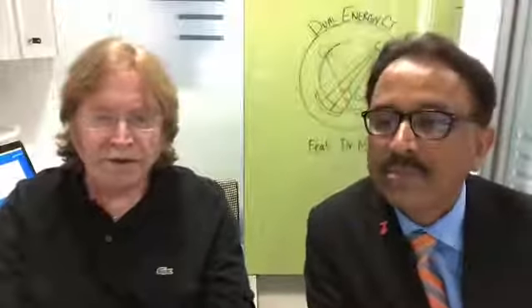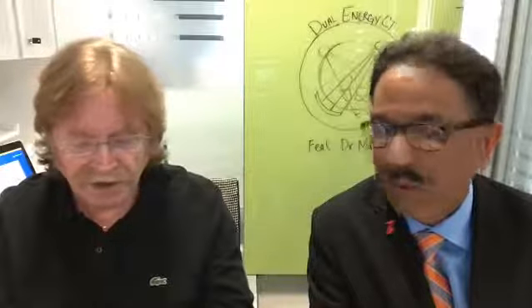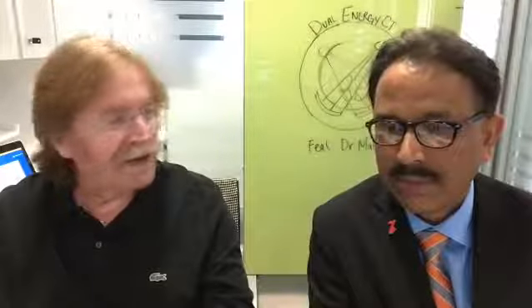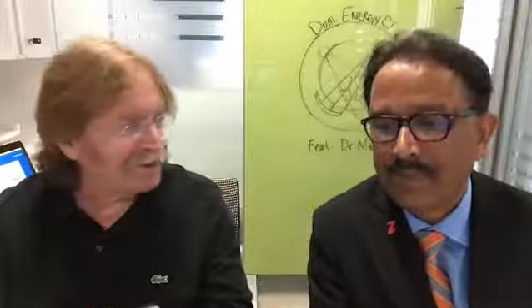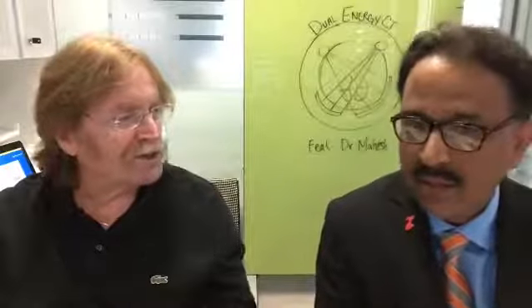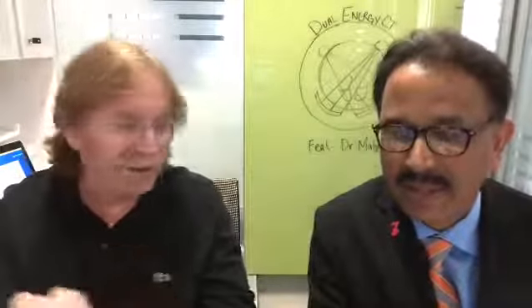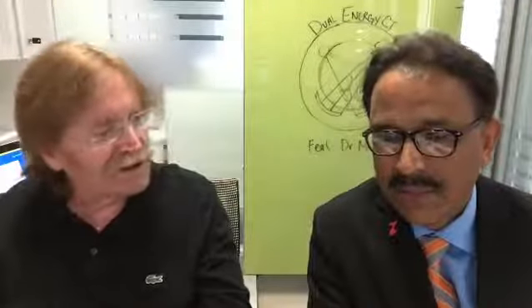I think that was a good question. If anyone has any questions, now's a good time to ask, by the way. The other question, I think, is a practical one I know from the society meetings: you create a lot of data sets. So you have a lot more data, which is both good and bad depending on who you're asking. And I think the problem is workstations really haven't been designed to look at dual data, where you can move things around, and you need to figure out ways of doing virtual dual energy and things like that.